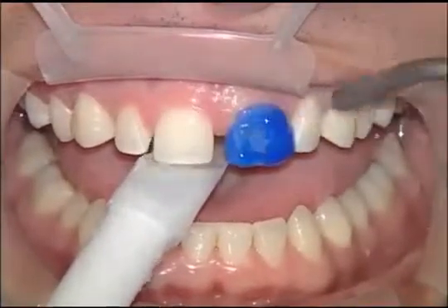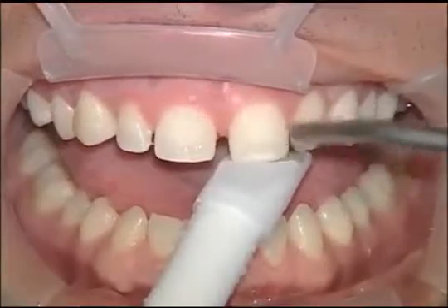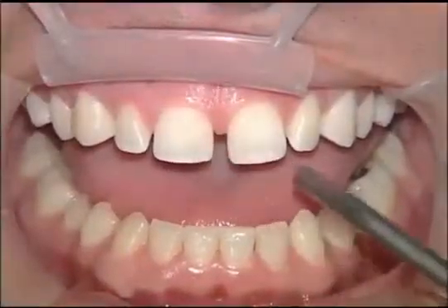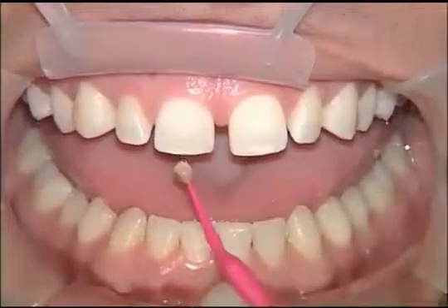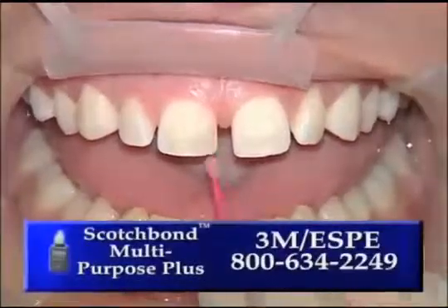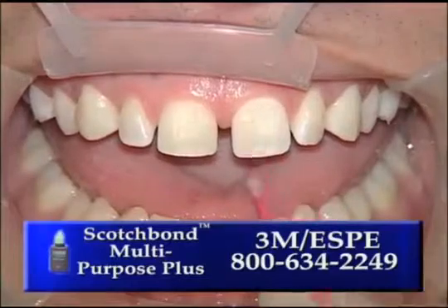We're going to go ahead and rinse off the 37% phosphoric acid. As you may have noticed, we have only etched the central incisors so far. And as we air dry this, you'll notice that we see that frosty appearance that we're used to from the old days of bonding when we were primarily etching enamel. What we're placing here is not your typical dentin bonding agent. This is just the adhesive from the Scotchbond Multi-Purpose Plus kit. And because we don't have any exposed dentin, we can just use the adhesive. There is no need for primer.